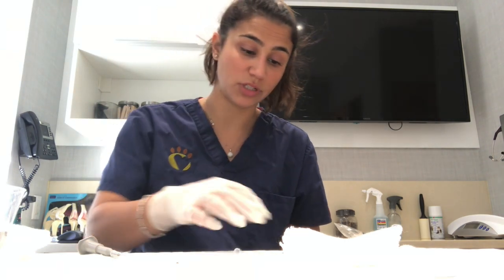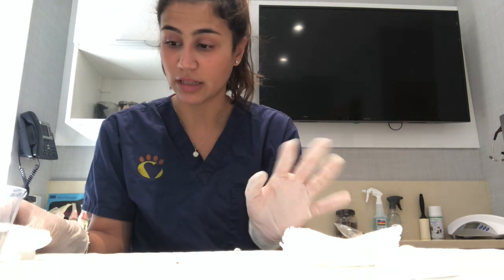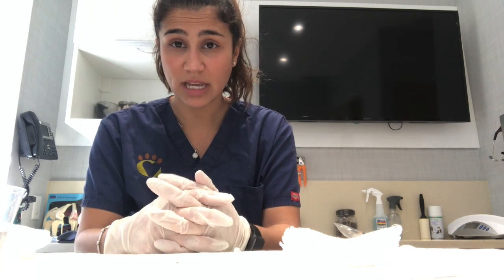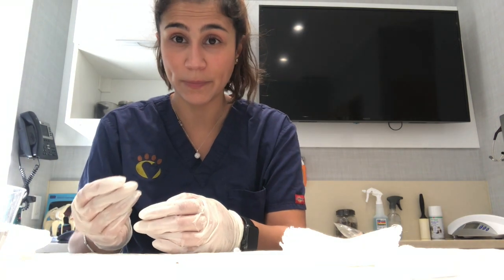For this specific test, it is common that we actually miss protozoan parasites. If we are looking for protozoan parasites, it might be better to do a direct smear. But for fecal flotation, just for common knowledge, fluke eggs have a higher specific gravity, so they will sink. So not all parasites will actually float to the top, but most will. Fecal flotations are very common in animal hospitals. We send them out probably 20 a day.